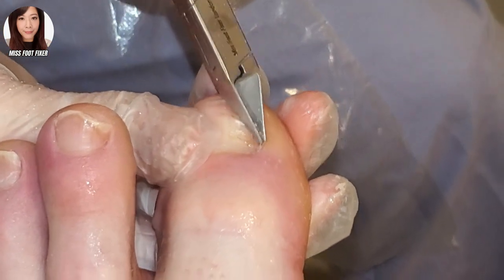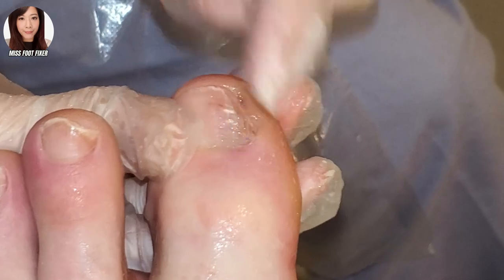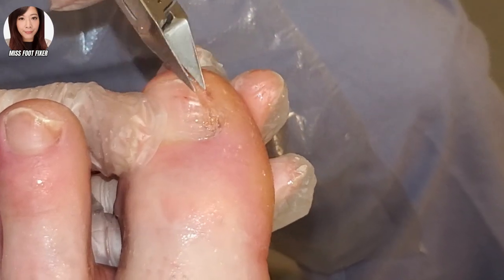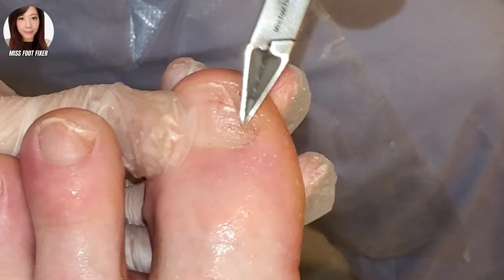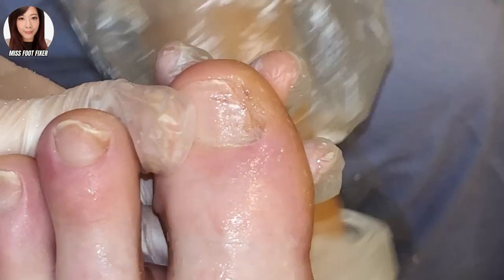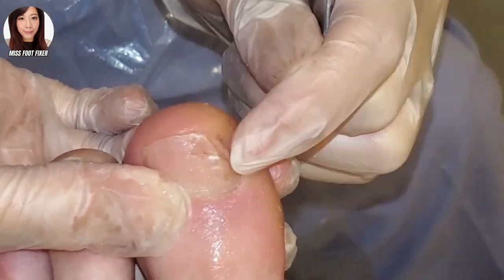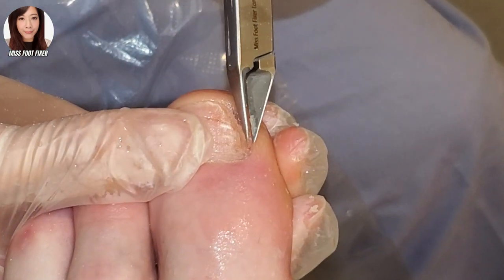Maybe it is the footwear, because it's so hard for him to get footwear that fits, and it's rubbing against the nail, causing lots of damage to the nail plate. Obviously there is a fungal infection too. And if you don't fix the mechanical cause, I think the buckling of the nail and the friction will damage the nail plate and then you'll have a vicious cycle on and off. There is also some nail bed damage on the side too.